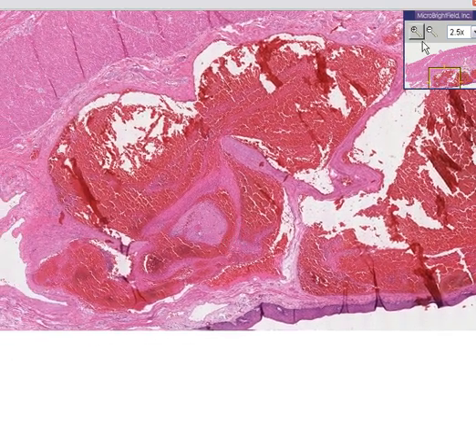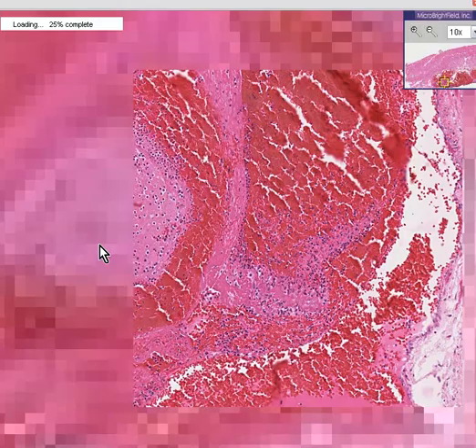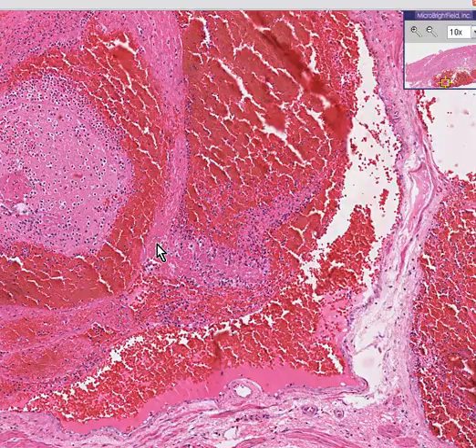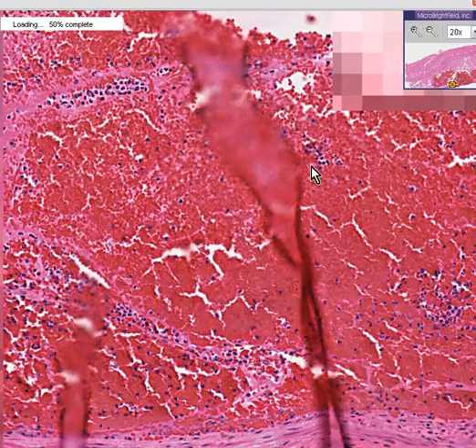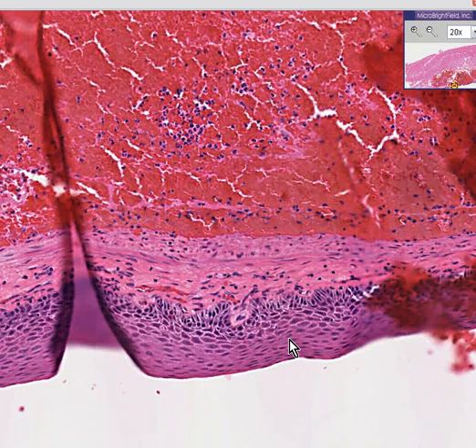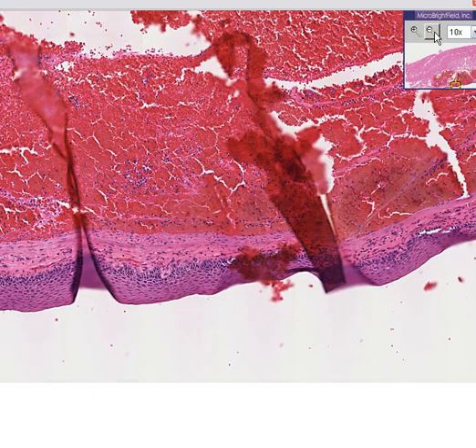And in this area here, it's also possible that there is an early thrombosis as well, because it looks like there are some inflammatory cells here trapped up in fibrin. But for the most part, it is non-thrombosed. But these are very, very large dilated veins, and they extend to within perhaps microns or fractions of a millimeter from the lumen. This is a very dangerous situation. Rupture of this large distended mucosal vein could very easily lead to quick death.